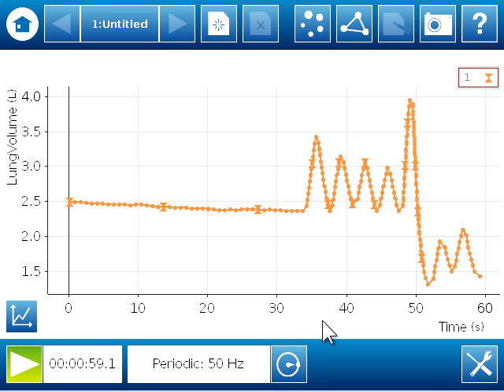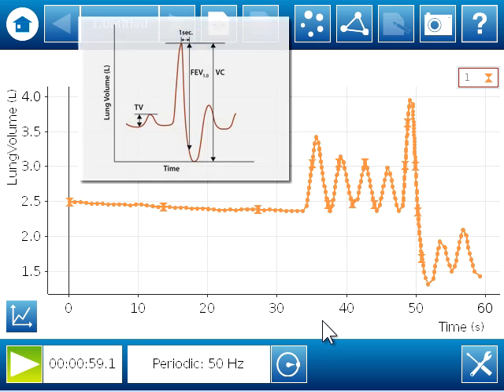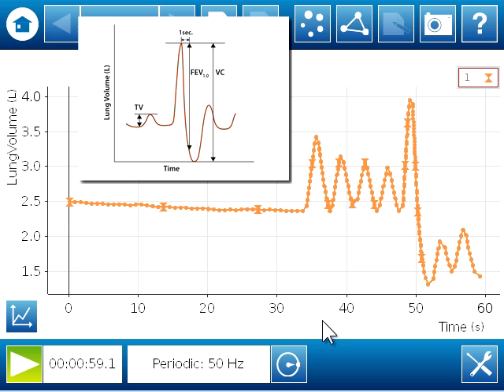And then you can see those changes in volume more clearly. Now the normal breaths will give us information about something the scientists call tidal volume, while the maximum inhale, followed by a forced exhale, gives us additional information about vital capacity and forced expiratory volume in one second. And these are values that would be important when analyzing, say, a person with asthma, and whether or not a treatment is improving the lung functioning of that person with asthma.